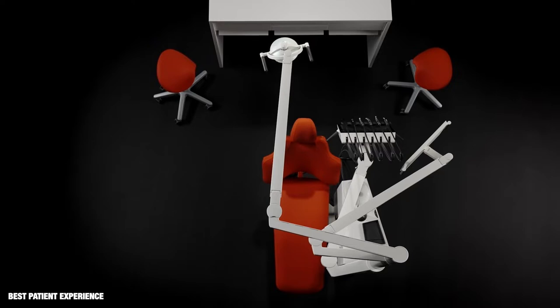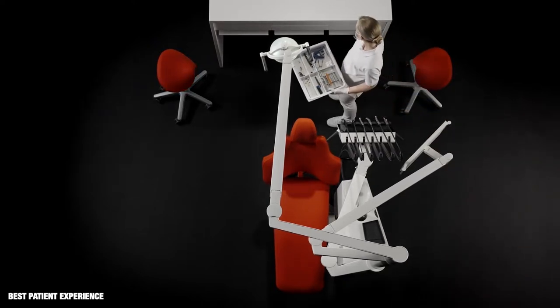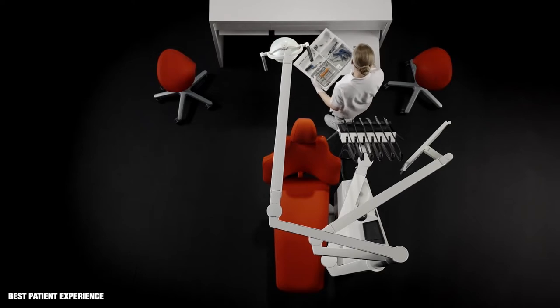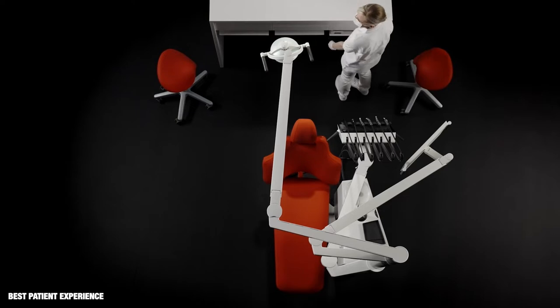To prevent cross infection, instruments and materials should be stored outside of the treatment room. Trays and tubs for the individual treatment can be placed on the EXO worktop.